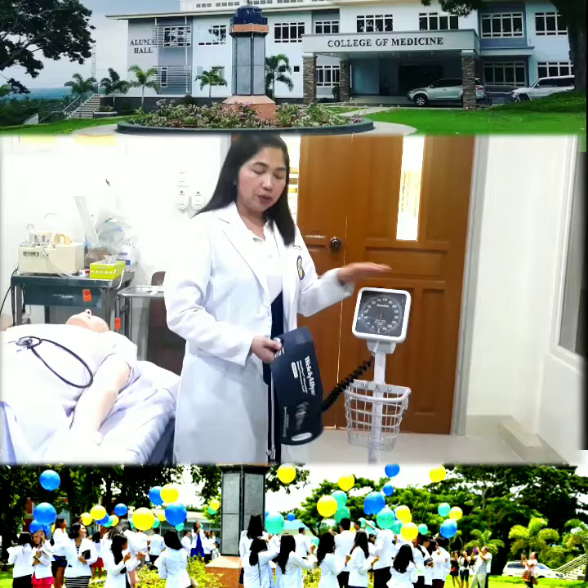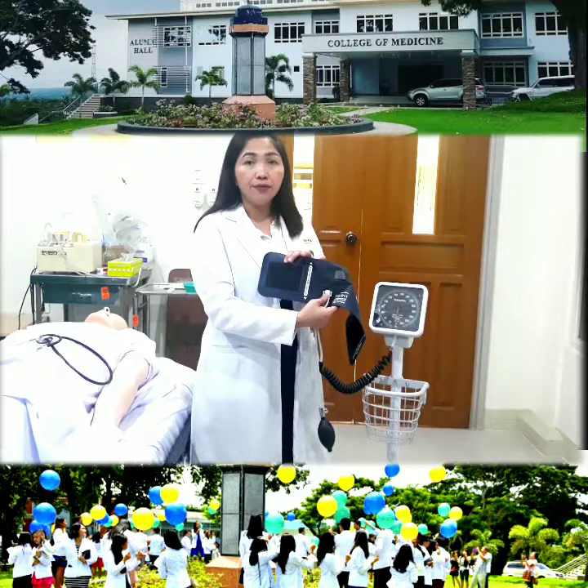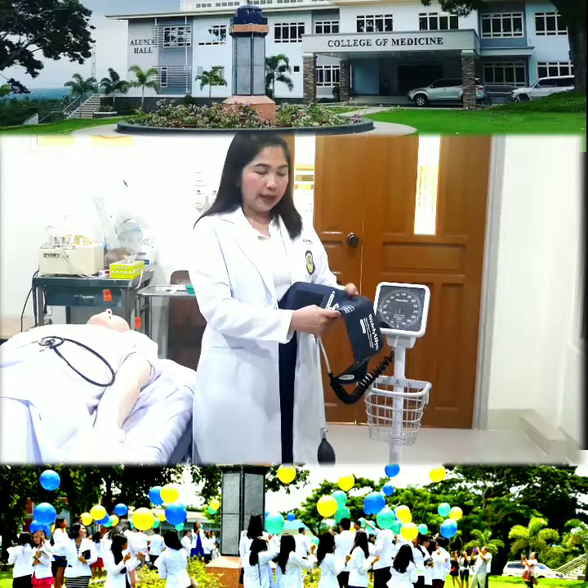This one here is the reading apparatus, or the manometer. This one here is the cuff. We call this the cuff, and it has sizes. This one is an adult cuff. If you have a pediatric patient, then you use a pediatric cuff.